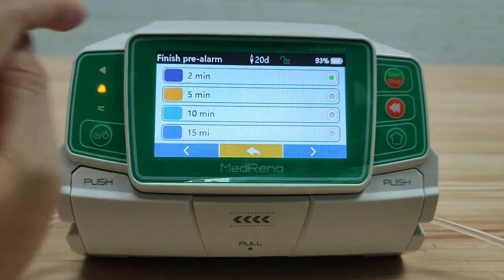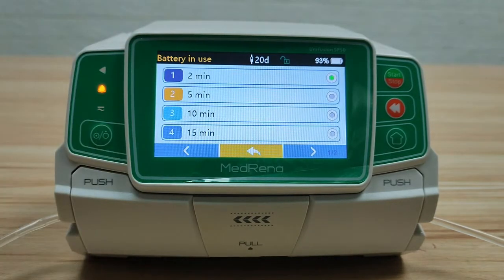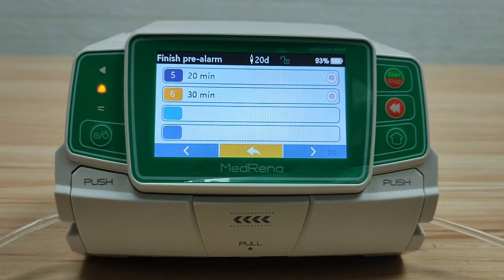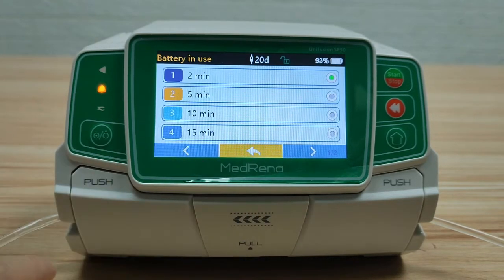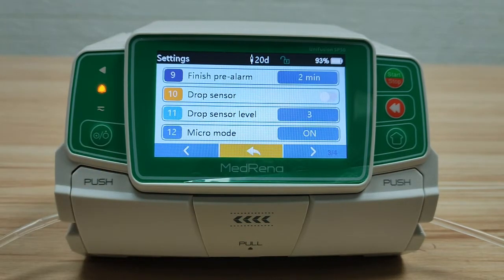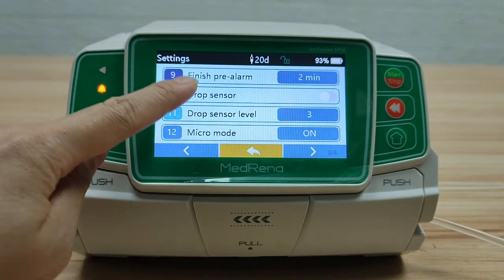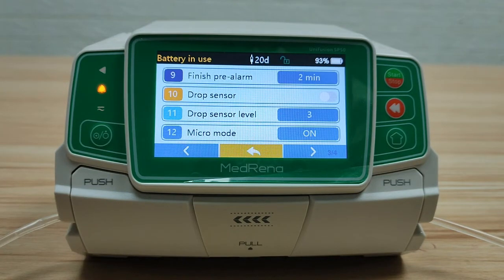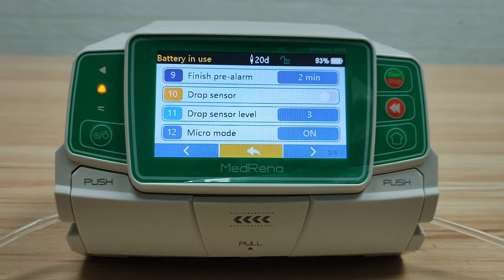Finish pre-alarm: choose the time that the pump gives an alarm before the infusion is about to finish. Drop sensor: the drop sensor is an optional accessory to the pump. It helps to monitor the drip rate and triggers an alarm when the reservoir is empty.